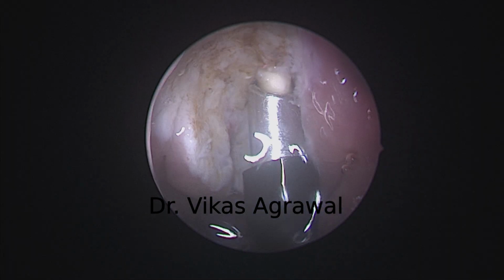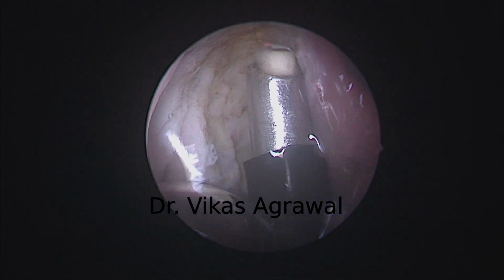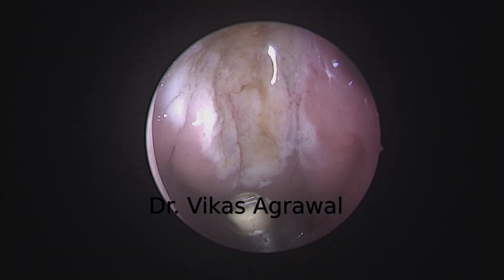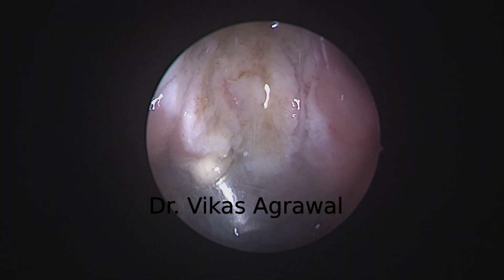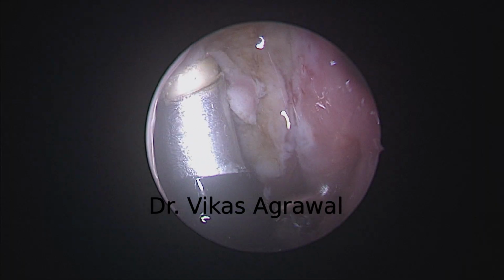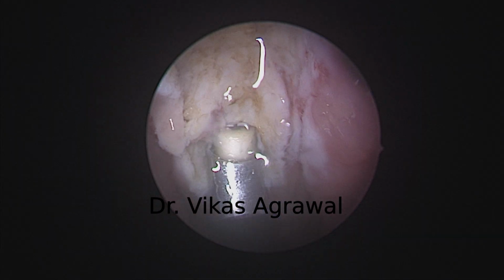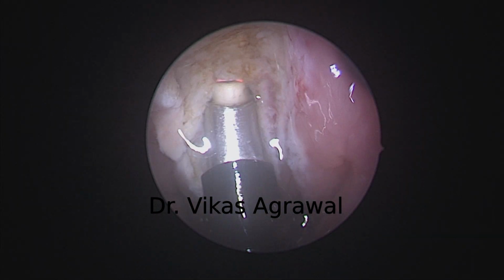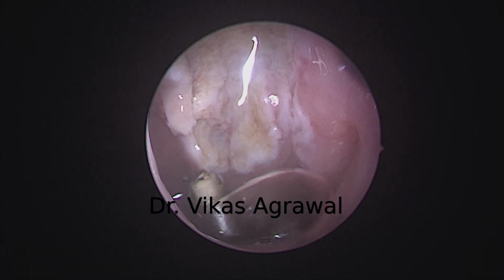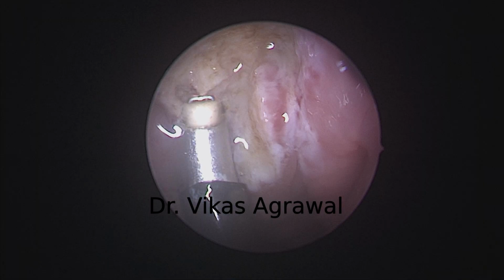We are melting the adenoid tissues layer by layer completely. That's the superior boundary, which is the periosteum below the sphenoid bone. You can see the periosteum very well. And the superior boundary is completely delineated. Once you go till the boundaries, adenoids will never recur to the extent that they require a surgery again.